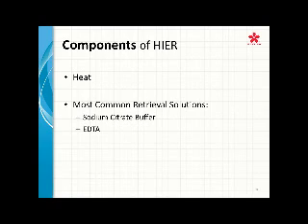I want to go over the two most common retrieval solutions used in heat-induced epitope retrieval: sodium citrate buffer and EDTA. Whenever you're getting ready to bring an antibody into your laboratory and you research the antibody, it will always have a specification sheet that will specifically tell you what type of retrieval you should be using for this antibody.